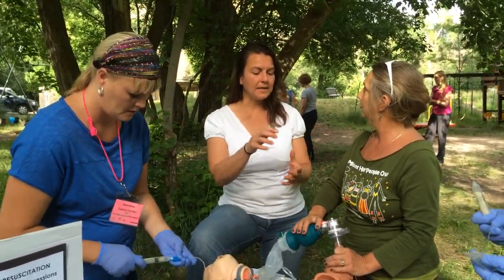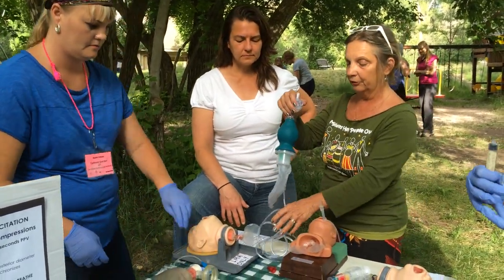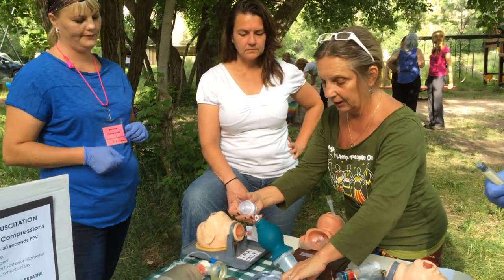So you degas the stomach and then you insert this, or you're saying it'll happen when it comes in the package. So you do one end and the other. So feel right here.